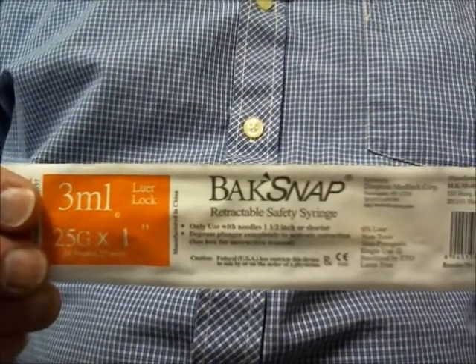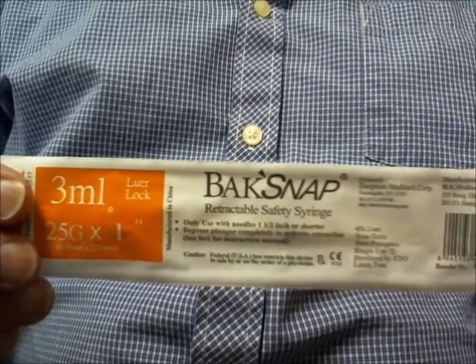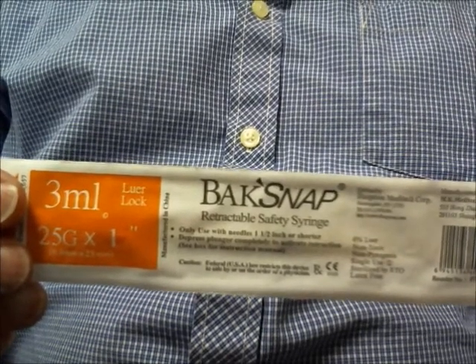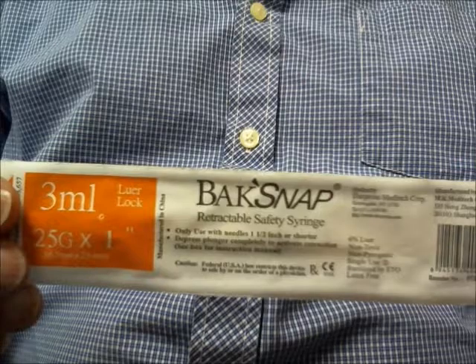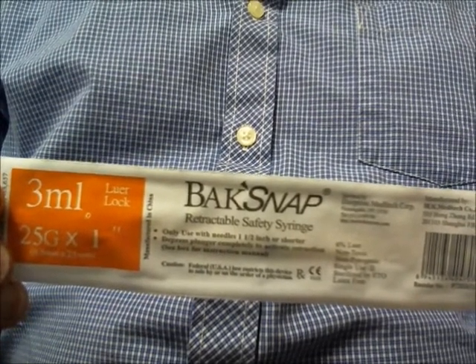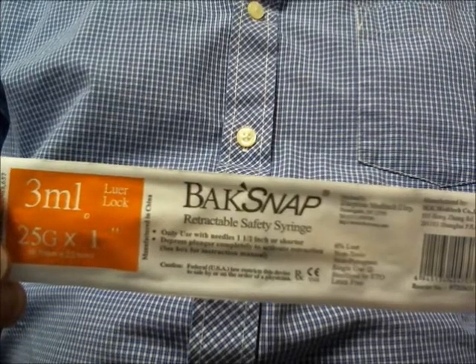Hello. This is a dosing tutorial for the BackSnap Safety Syringe. The unique technology of the syringe necessitates a slightly different draw-up procedure than what you may be used to. Simply put, you will draw extra fluid into the syringe and then return the excess back into the vial.